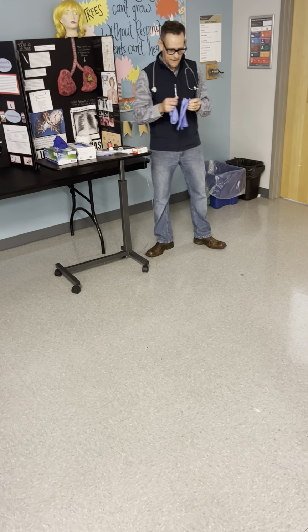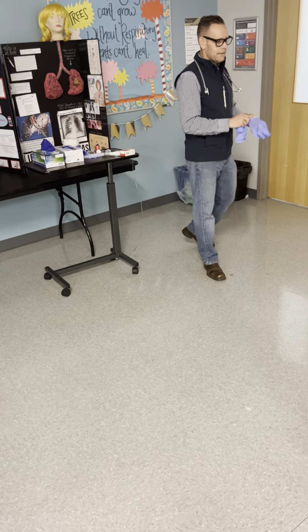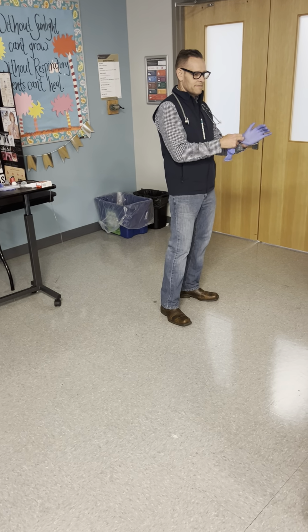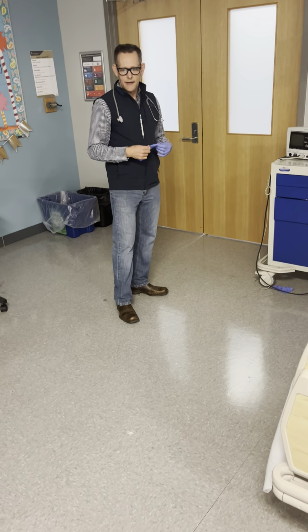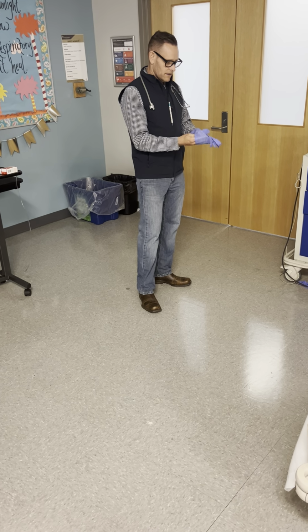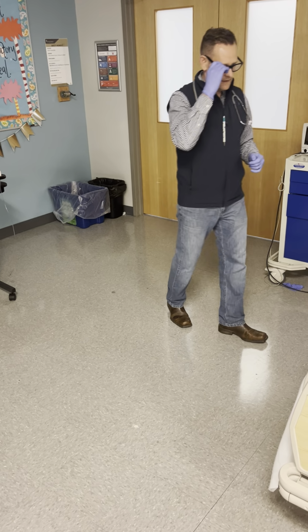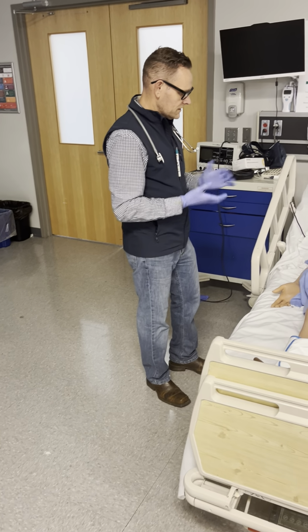Hey patient, what's your name? And they're going to tell me, Ms. Beatty. I'm James, I'm with respiratory therapy, and I'm here to do an assessment on you. I verified her, I told her what I'm here for, and I explained the procedure. I'm going to do an assessment, which involves checking your pulse, your blood pressure, and your saturation. Do we need to say we verified physician orders before we came in? Yeah, did that.